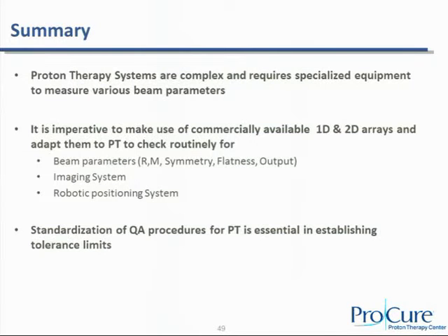Standardization of QA procedures for proton therapy is essential in establishing tolerance limits, and I'm hoping that the task groups are going to talk about that in the future, because they are different for every mode of delivery.